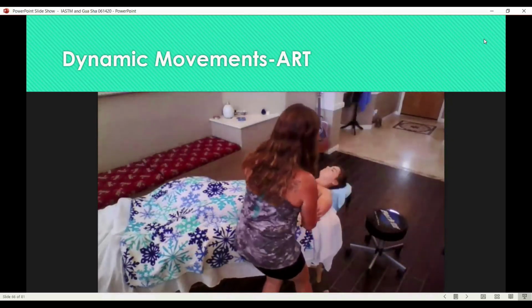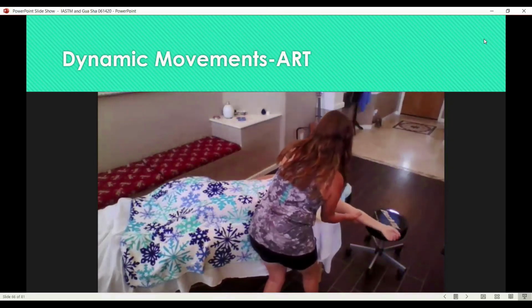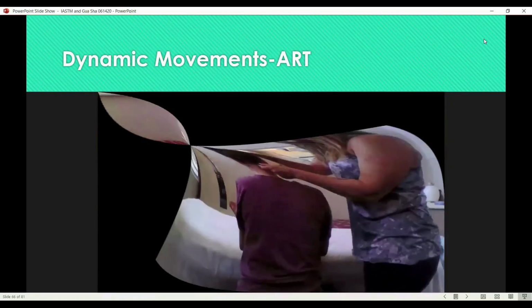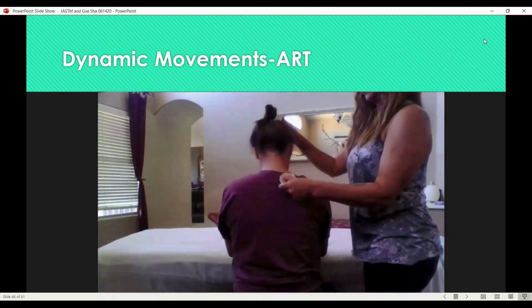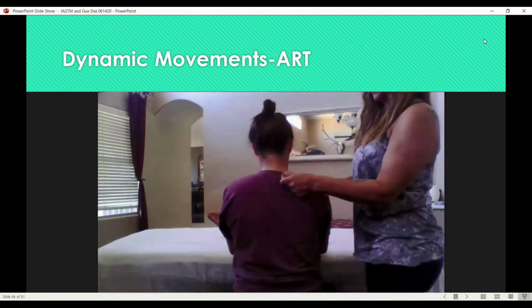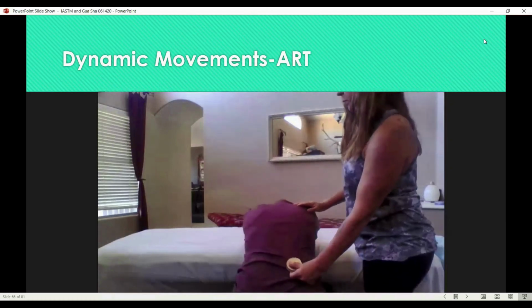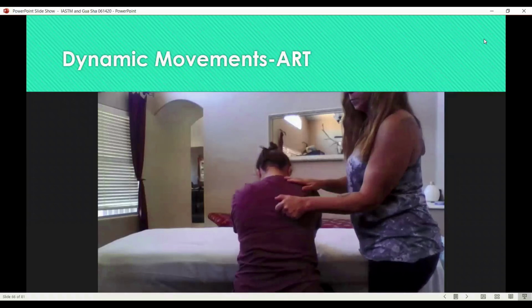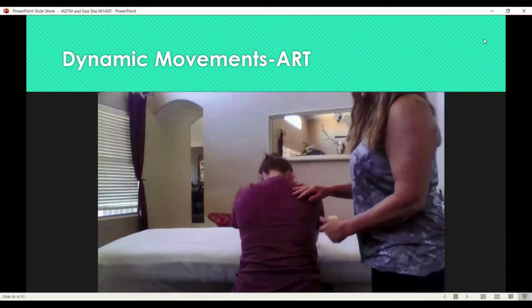You're trying to figure out how you could see me work and you see at the same time. Right, here you can see an idea of what you could do. We're just making an example through the shirt here, but first I was just doing the cervical, just head to chin or chin to chest, and now I'm having her bend at the waist. We can work all the way down.